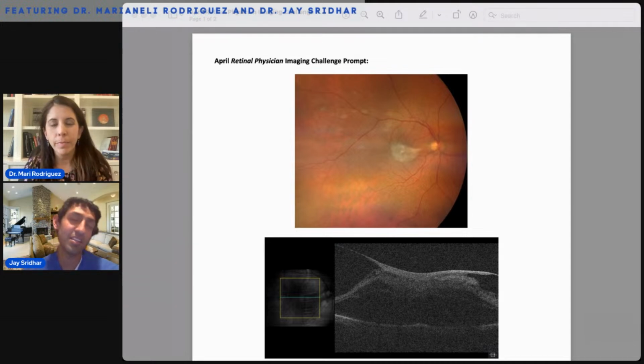I think, and this is my humble opinion, we always have to think about what the goal of the procedure is, right? So this is not a macular hole where the goal is to reduce the ILM traction to help the hole close. We don't know for sure how that works, but that's what we think. In ERM, you're essentially trying to reduce distortion and get better foveal contour. So as long as the traction is off the fovea and the perifoveal area, I mean, if it's sitting there and it's standing up, I'll take that ERM or ILM a little further out. But I always joke as I'm doing it when I'm talking to a fellow, it's vanity points. You're doing it because it's there, but you don't have to.